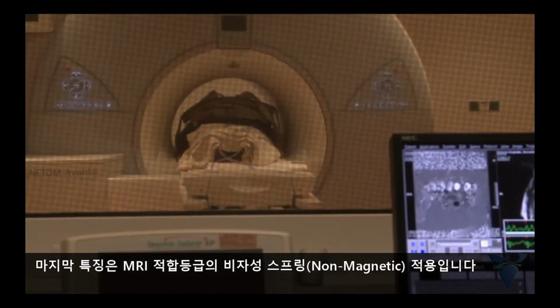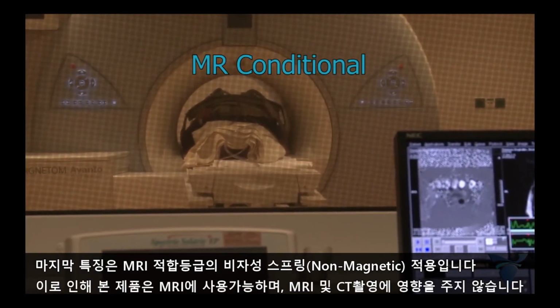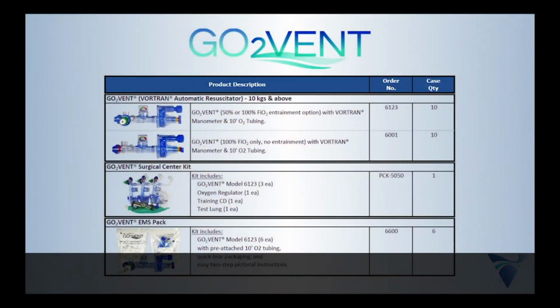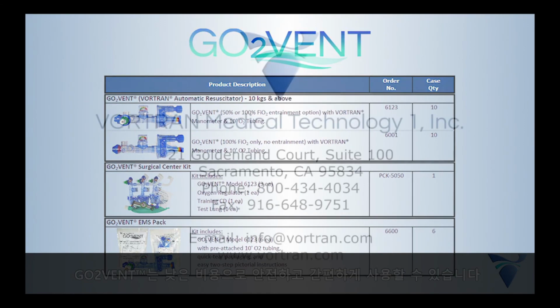One last feature is the inclusion of non-magnetic springs. The device will not affect imaging and is labeled as MR conditional. The VORTRAN GO2VENT is a cost-effective, safe, and easy means to manage your patient's ventilation.